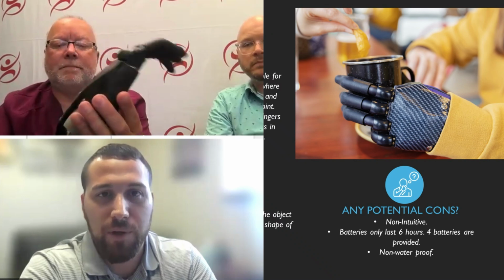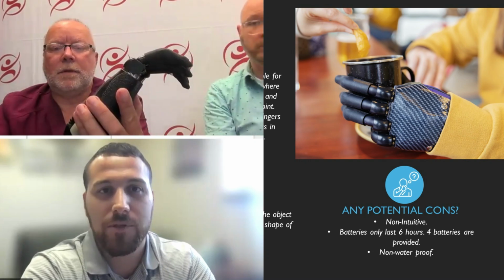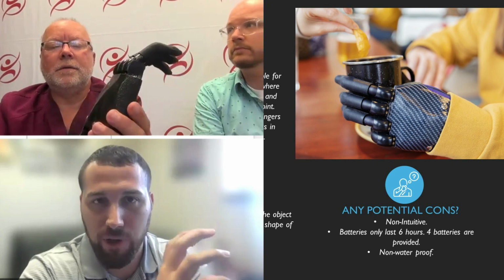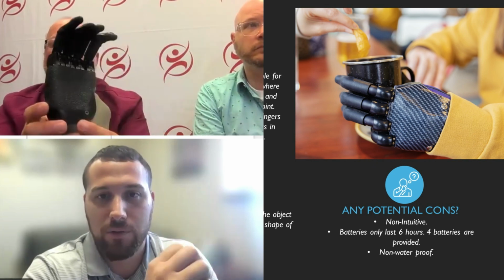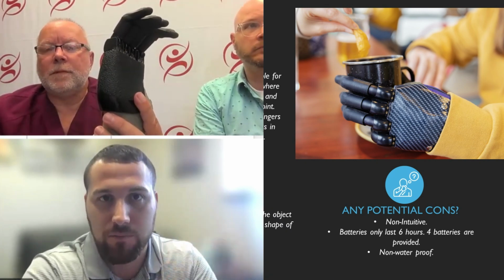There's a lot of time spent in therapy learning how to isolate those muscles. You'll say relax 1,000 times, trying to get there not to be interference and for those signals to be clear, so that partial hand or that iDigit understands essentially, what is this patient trying to tell me to do? Am I trying to open or am I trying to close?